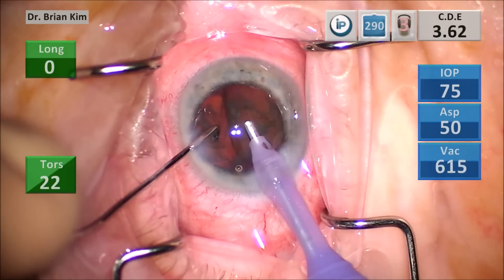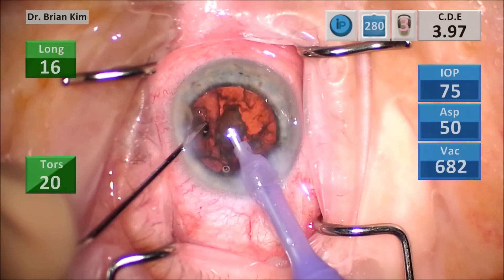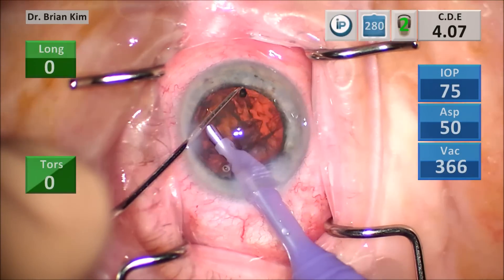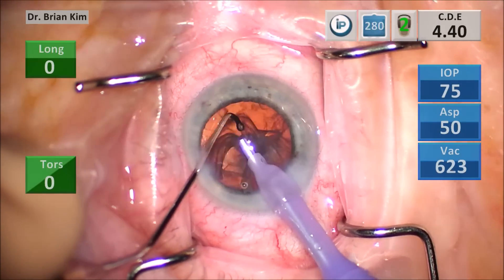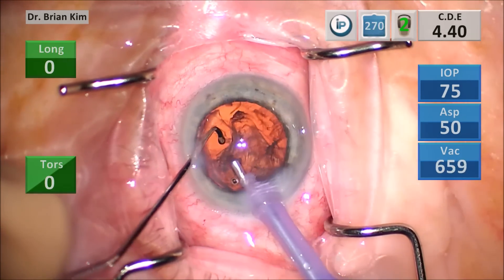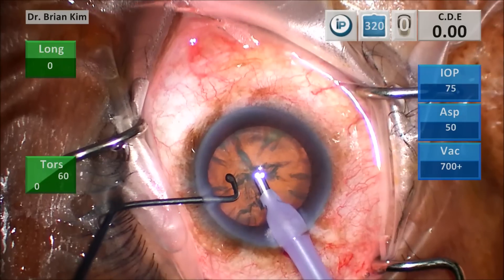I like to lead with the tip, push down a little bit to make sure I'm underneath the anterior capsule. And as I approach the equator, I rotate my wrist so that the chopper tip is facing me, so that the lens piece will be held effectively.